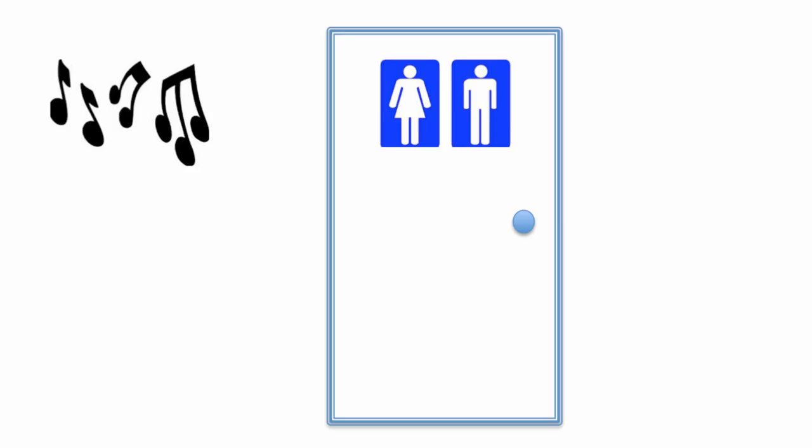A more concrete example of how a dense object is a high-frequency filter is to think about the bathroom door at a music club. When you are in a music club, you hear a mixture of both high and low-pitched frequencies. However, when you go to the bathroom, usually you only hear the thumping of the bass, the low frequency, after you close the door. When you are finished and open the door, all of a sudden high frequency becomes more obvious.